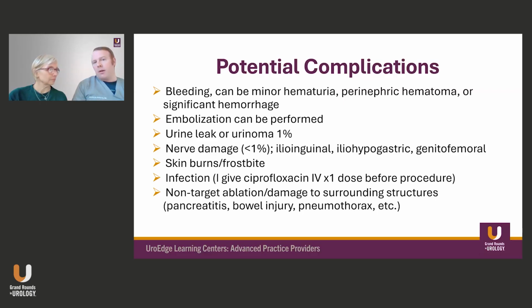I canceled the procedure this week for a patient with a 3.7 centimeter mass that was right next to the colon. I was about a centimeter away from the colon on the supine scan, the planning scan. And then when I flipped her prone, the colon was immediately adjacent to the tumor. So I even tried to inject some sterile water, called hydrodissection, to try and move the colon out of the way, and that didn't work, so I had to cancel it. But luckily, we have our excellent urologists to help us.